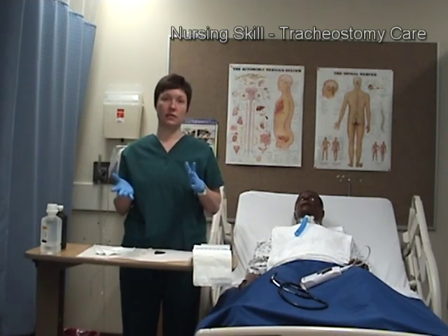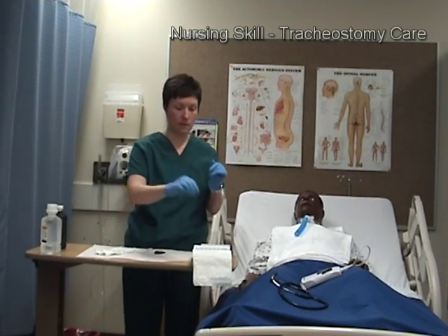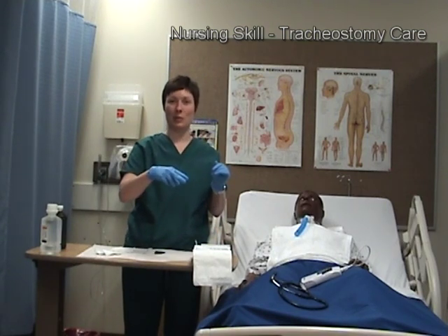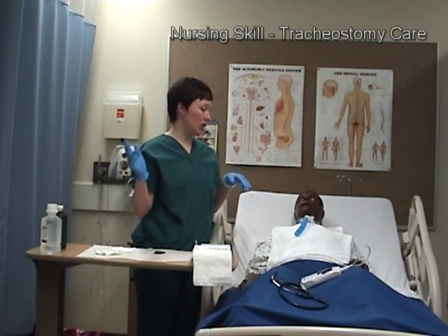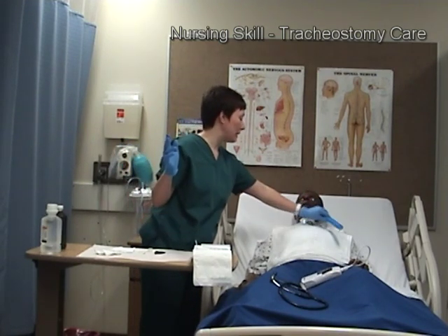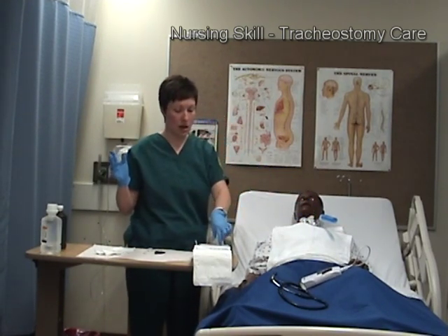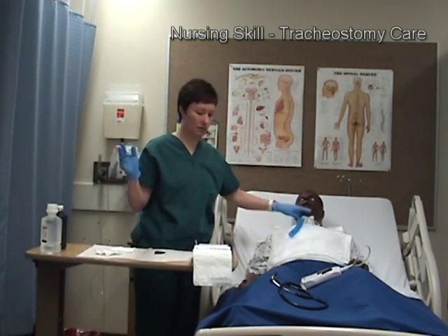I'm now going to identify my sterile hand and my clean hand. With my sterile hand, I'll remove my cotton and cleaning supplies from the normal saline. I'm going to make sure the patient's oxygen saturation is stable, and with my clean hand, I will remove the inner cannula. This is dirty, so I'm going to drop it into my half-and-half solution and replace the oxygen mask while that soaks.